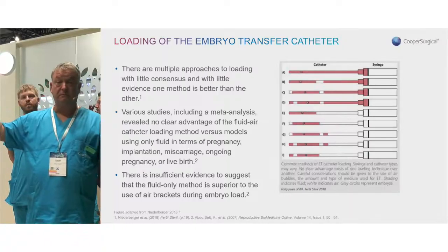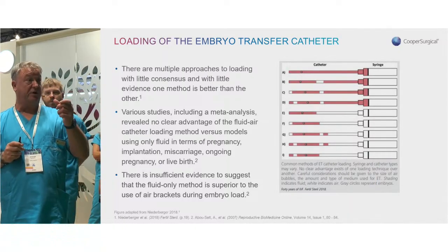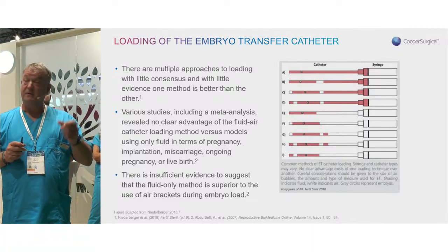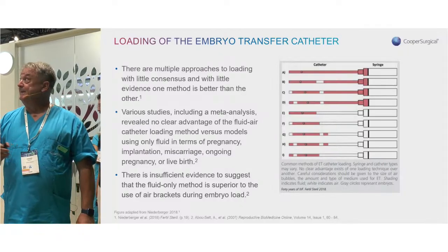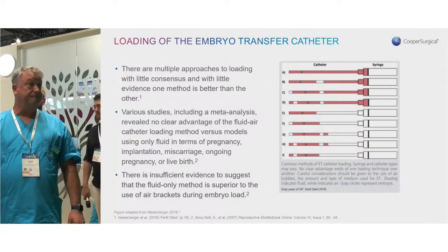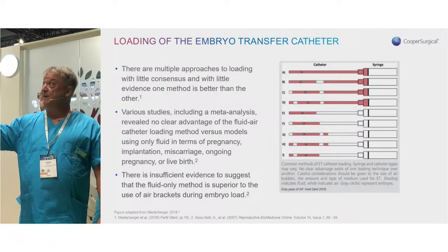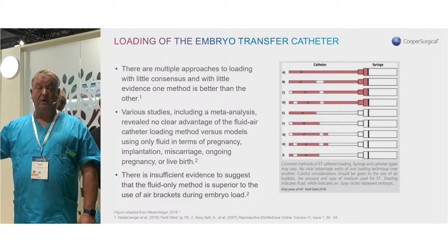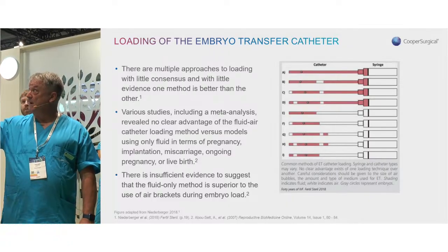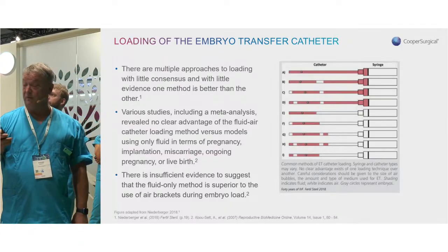And if your clinician or nurse that does the transfer likes to feel a big push on the syringe that you use, then you need to load air to make that syringe push further. You can't keep adding medium. And we'll just demonstrate one way of loading the catheter as one of these, but there are many ways to do it. So as I mentioned, you can load in different formations like this, but the volume that you load in is the critical factor.